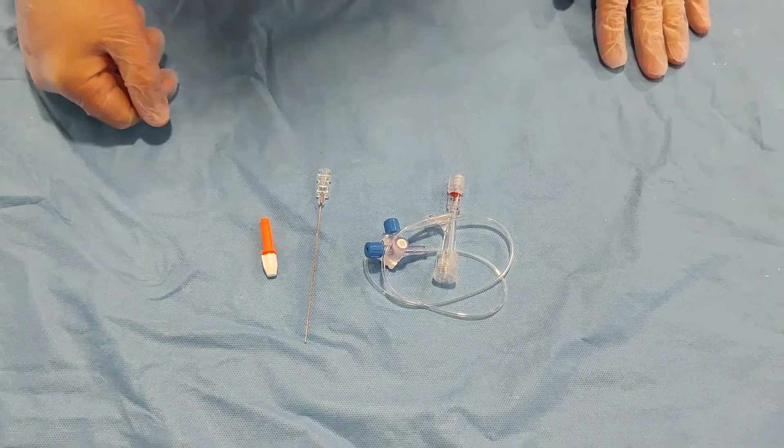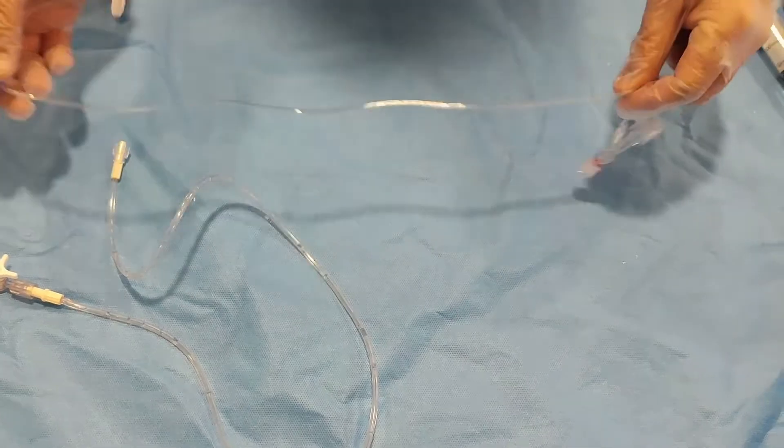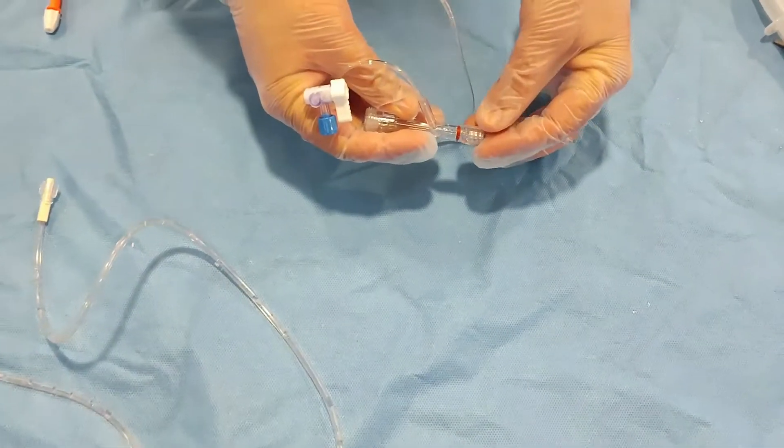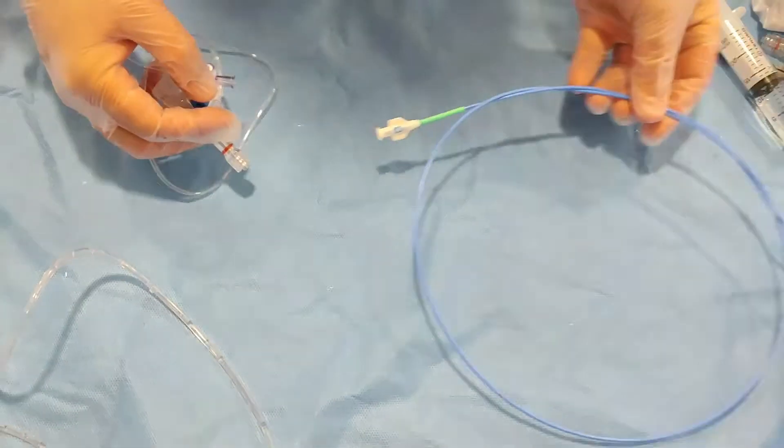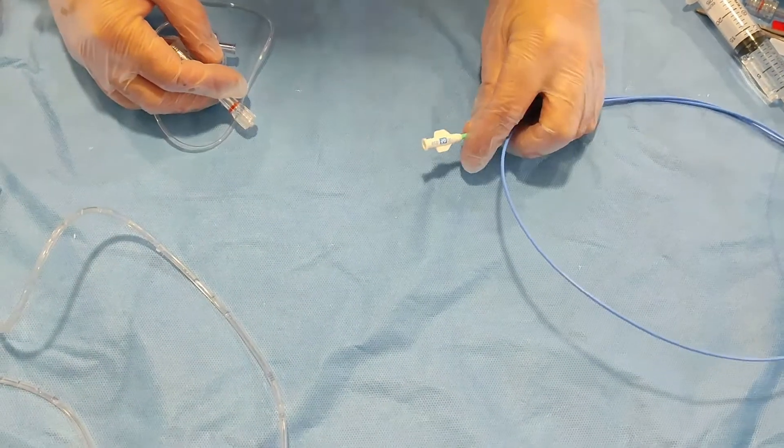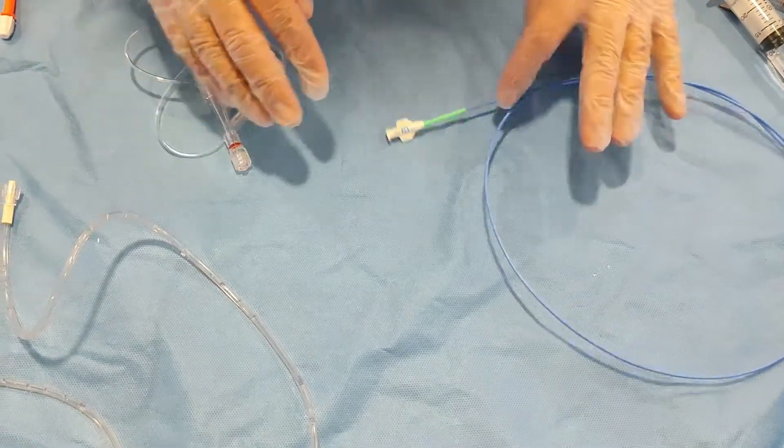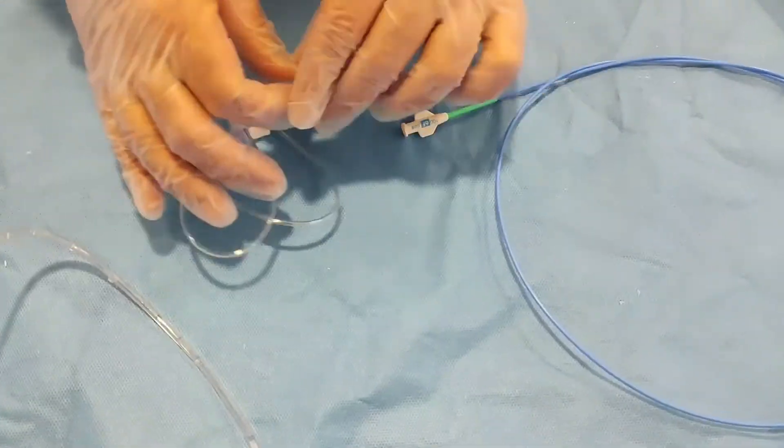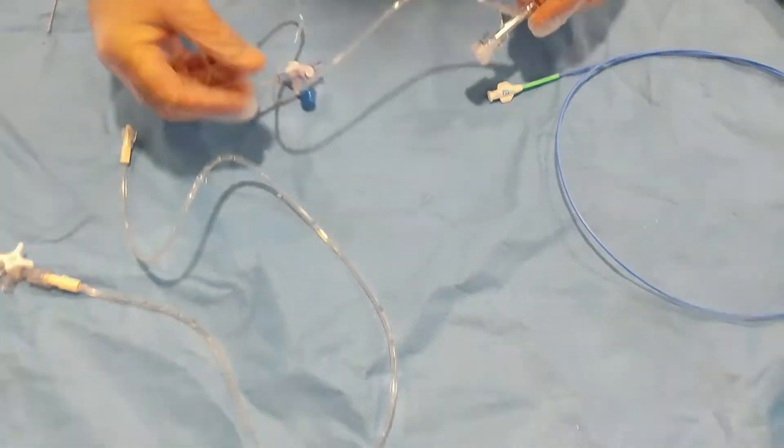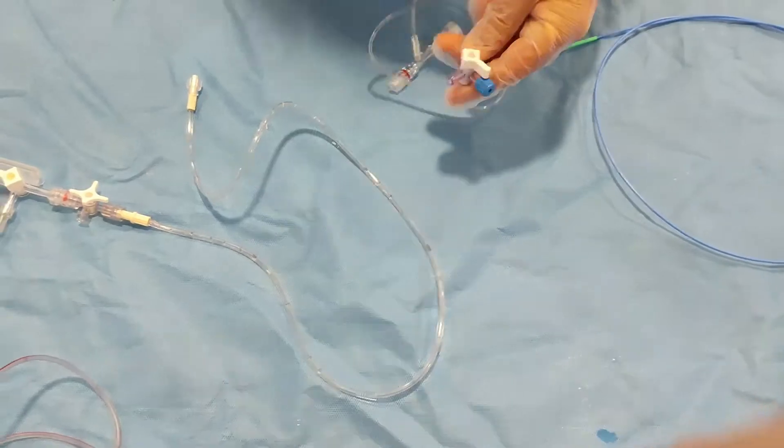Now I will show you how to use it, how to connect it. So make sure this is not connected to the patient. Assuming this catheter is a guiding catheter inside the patient, inside the sheath, and this tip is out. Do not connect it unless you make it ready.